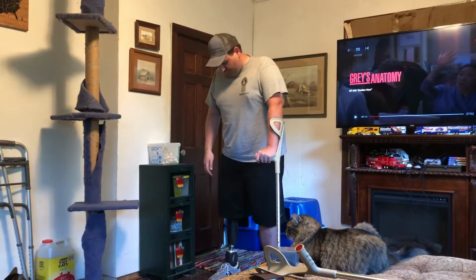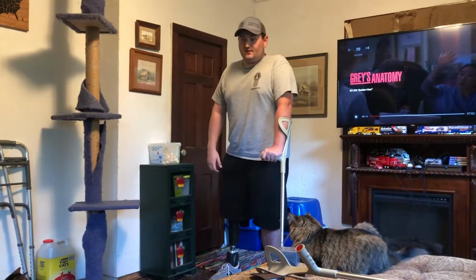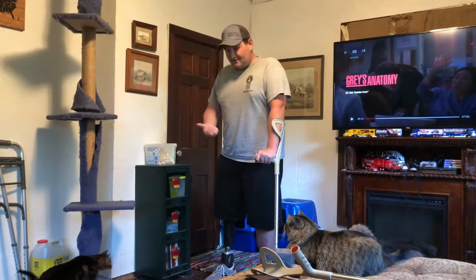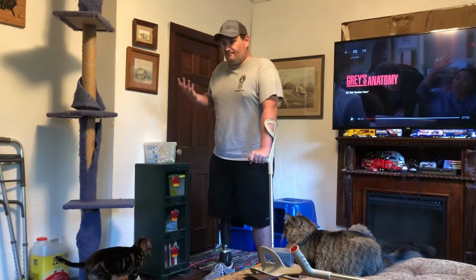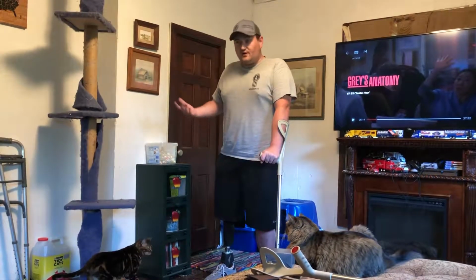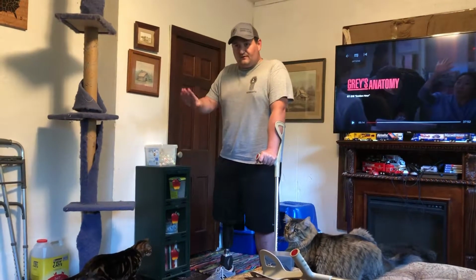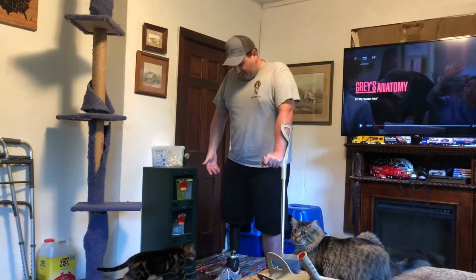I really like the foot. I like it a lot better than the Proflex, which has a torsion ball on the bottom of it. It has a lot of side-to-side roll, and they said that I'm really weird, that I don't like that. Most people do. I don't like it. I just like the normal movement of an ankle, you know, up and down.